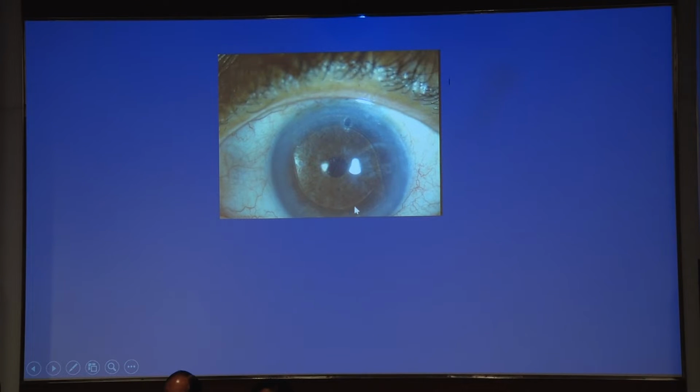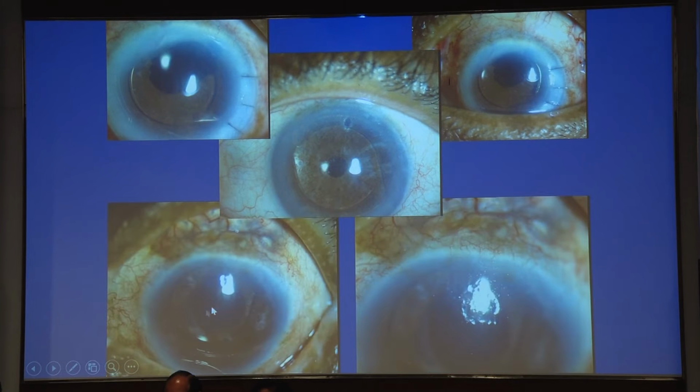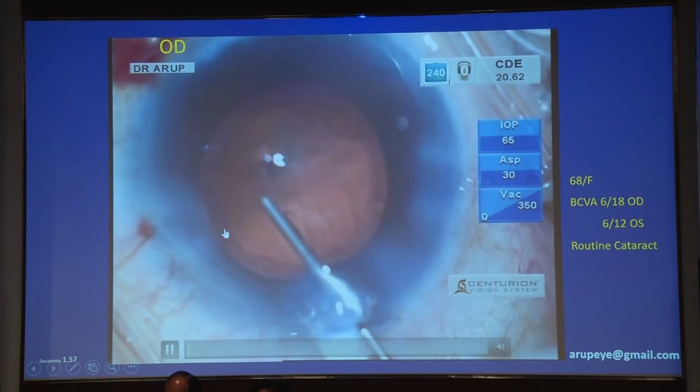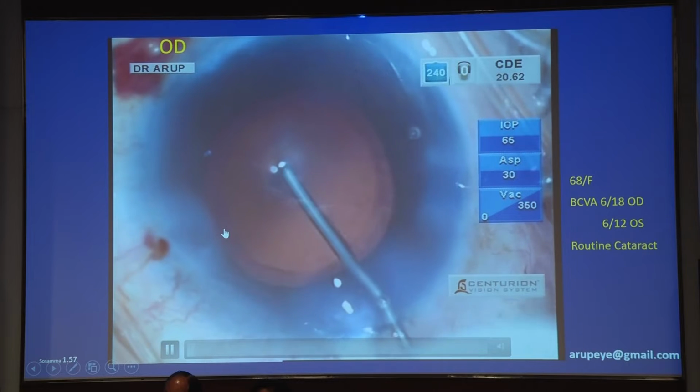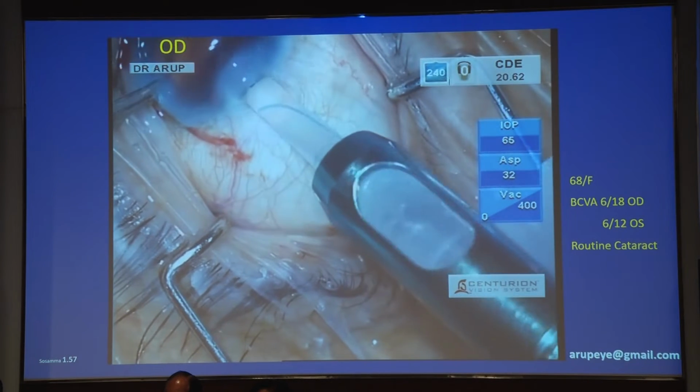Regarding AC lenses, here you have a situation where the surgeon has used a very big-sized anterior chamber lens, and that is again flipped. Similar situations, here again an AC lens, where the trailing haptic is still present in the section. So this actually is a good lens, but it has not been appropriately handled. In my presentation, I'm going to show you a few cases where PC rent was encountered during IOL implantation and how those cases were managed.